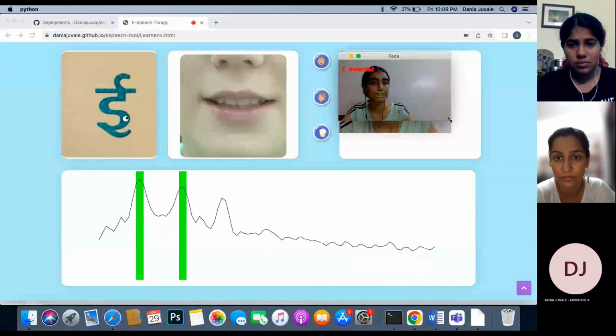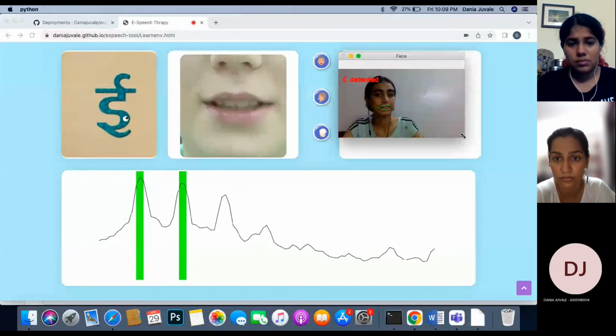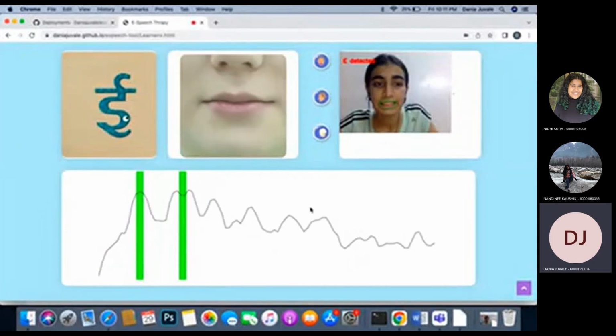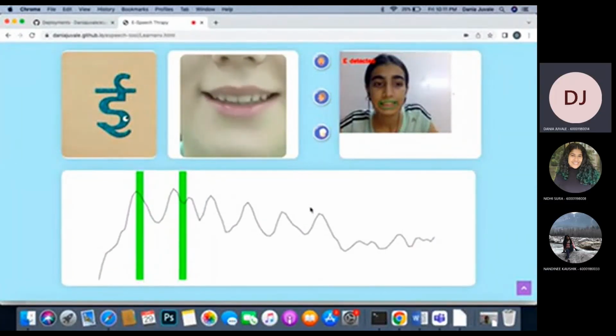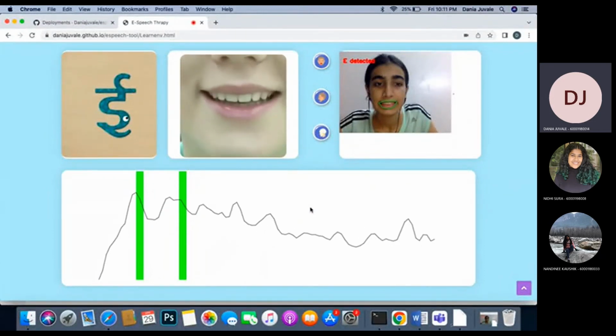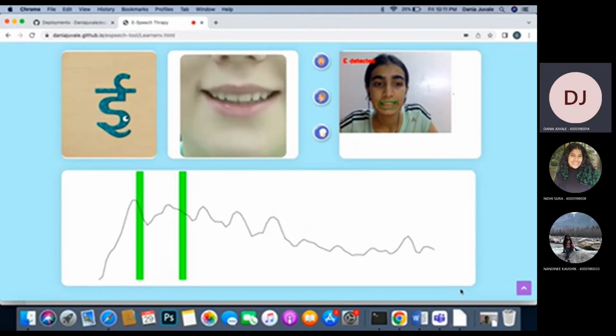E, e. This is the design of our web app along with formant extraction, lip boundary detection, as well as detection of E. Over to Nidhi.